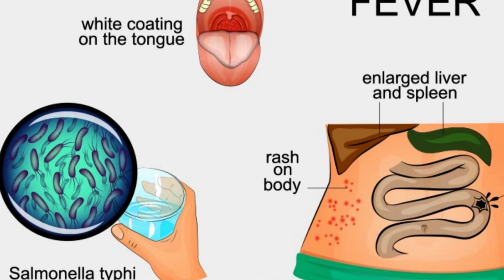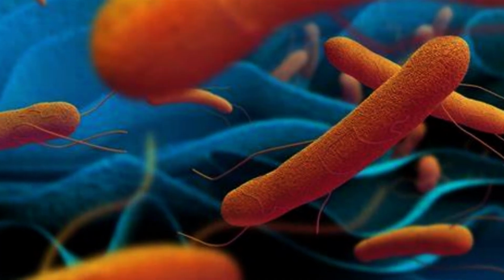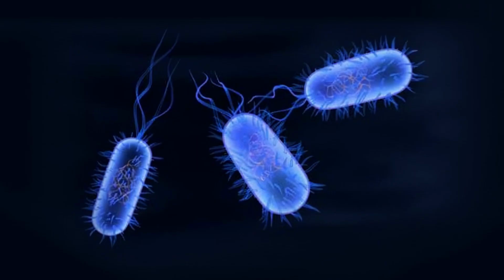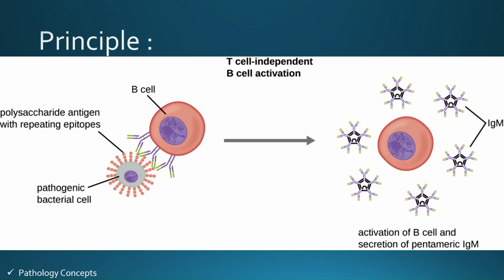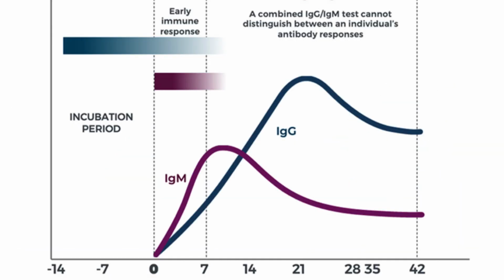Principle. The enteric fever occurs when the pathogenic microorganisms like Salmonella Typhi, Salmonella Paratyphi A and B infect the human body. During the course of the disease, the body responds to this antigenic stimulus by producing antibody whose titer rises slowly in early stages, then it reaches maximum level and then it slowly falls till it is undetectable.